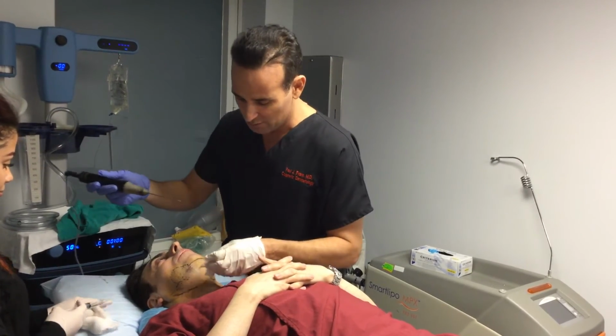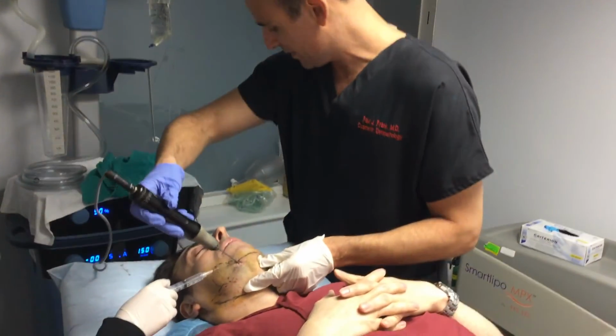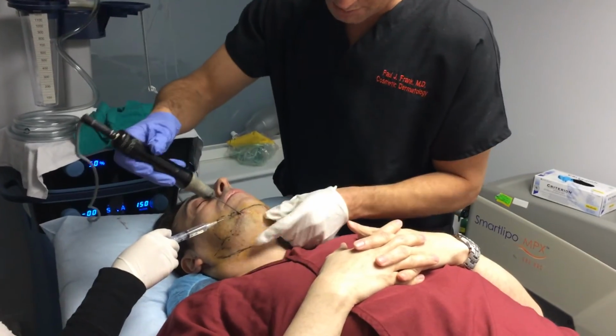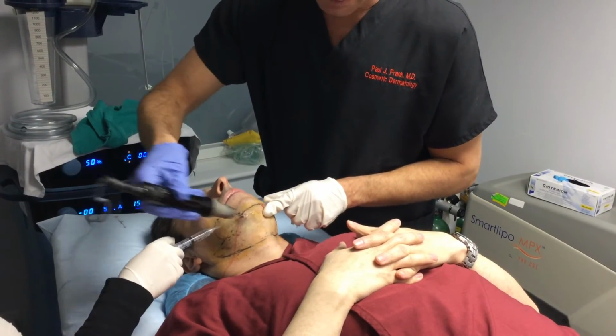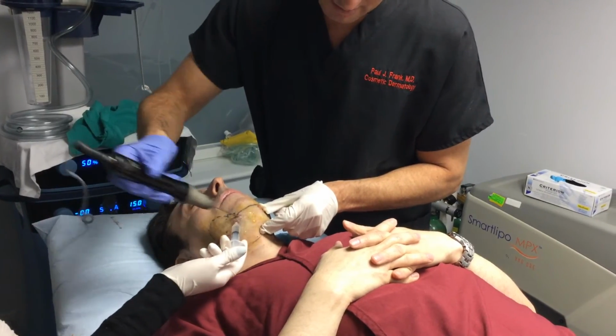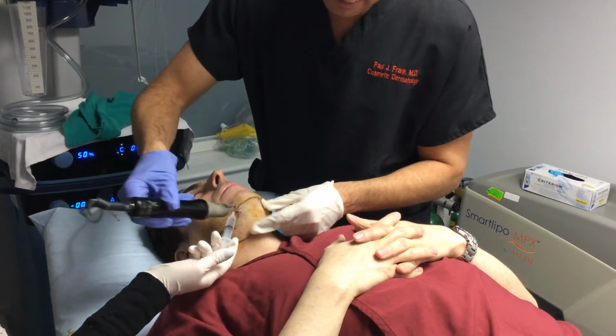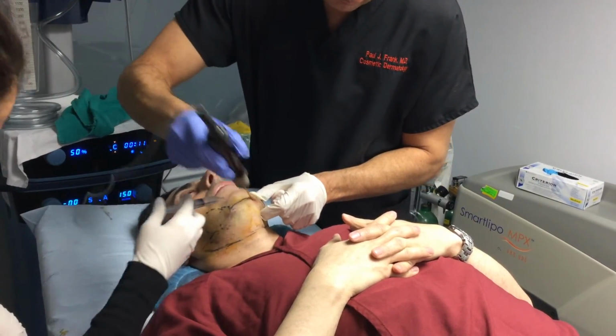So if you could focus a little bit more over here, I'm just going to briefly show you what we're doing here. The patient will not be able to feel any pain. We're going to run a little water to protect the skin. And you may or may not be able to hear anything right now, but what I'm doing is I'm breaking up the fat. In the deeper plane, I'll be able to come into the jowl area.